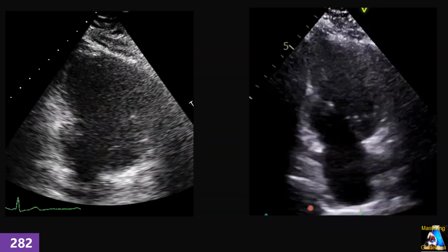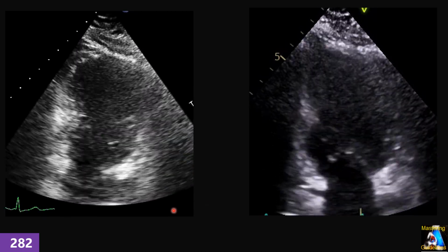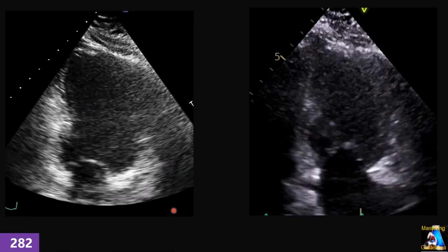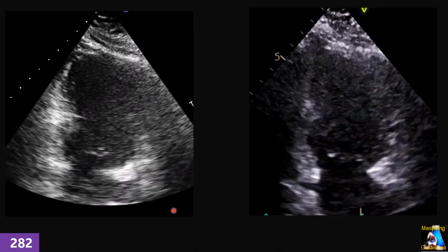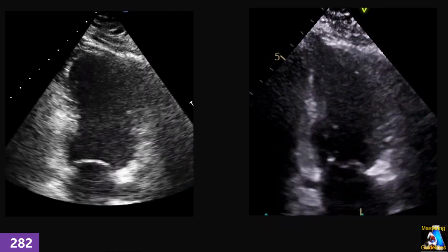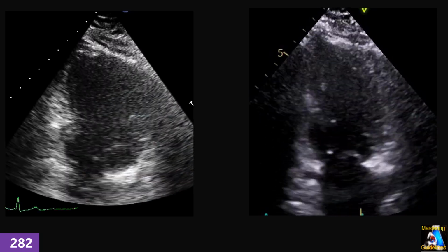What about these two cases? Does any of them have a basal inferior wall motion abnormality or not? What is your reasoning, and how can you get more information and more supportive data just based on the echo, not EKG or blood test, CT scan, all those things?